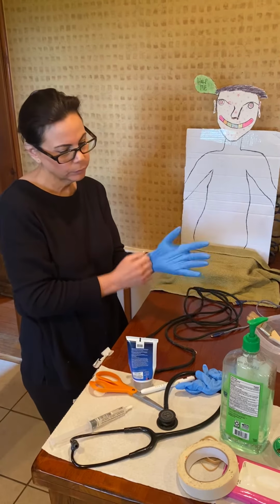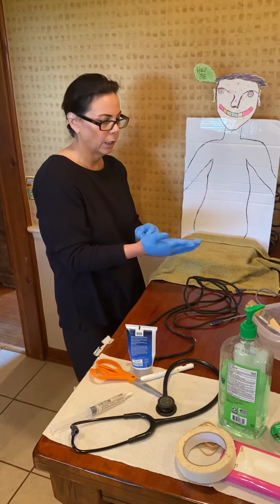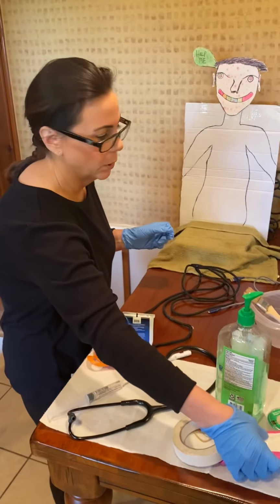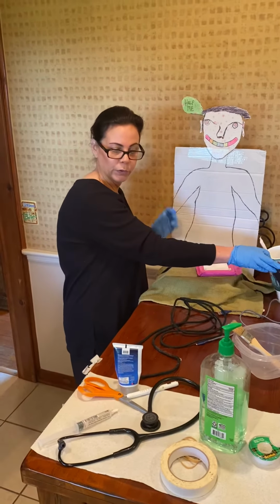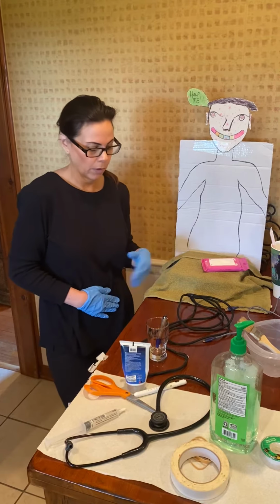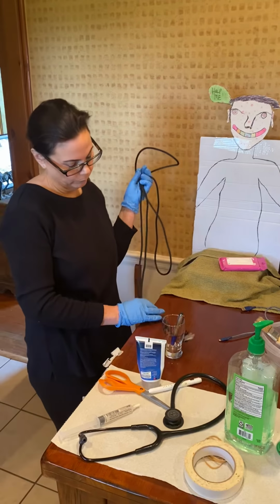And my patient is back in the high Fowler's position. He has his chuck on. I am going to give him some Kleenex. He's got his cup and his straw. I have here my glass to measure the gastric contents from this procedure.